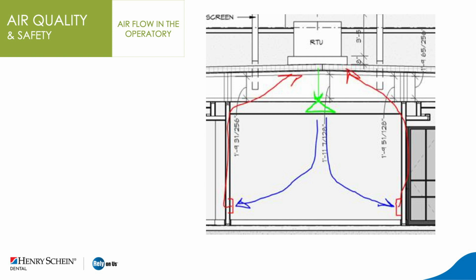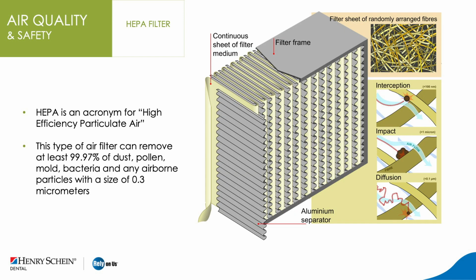And so if you're in a more northern climate, this may be exactly the opposite of what you have right now. But our concept, again, is to drive down the aerosols away from the face of the staff and the patients and down to the return air so it can be filtered. Now, speaking of filters, let's take a look and think about filtration for just a little bit.